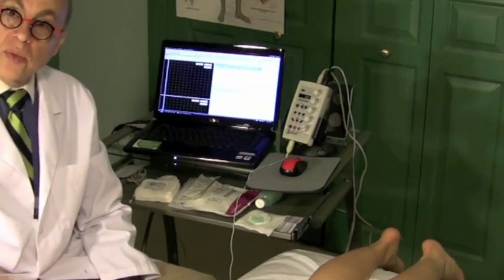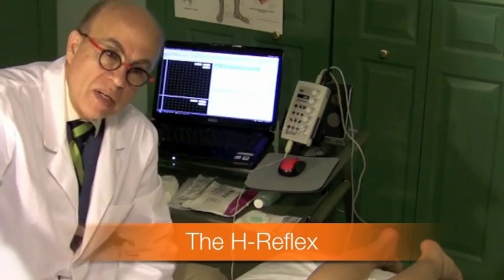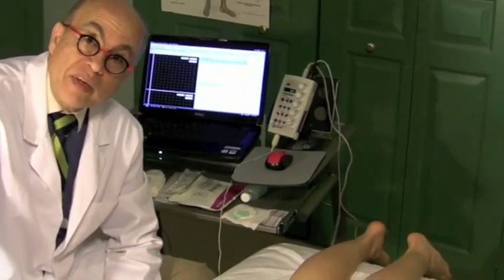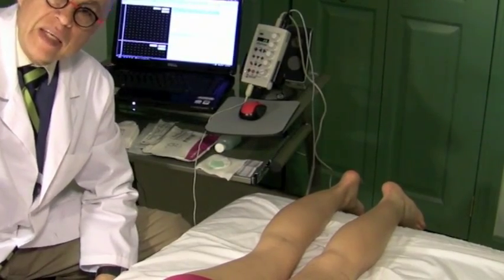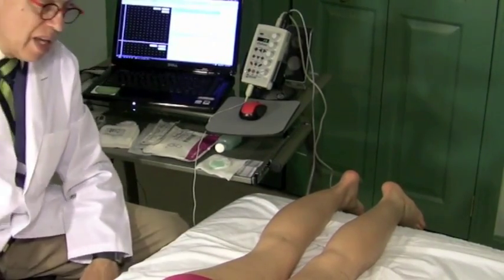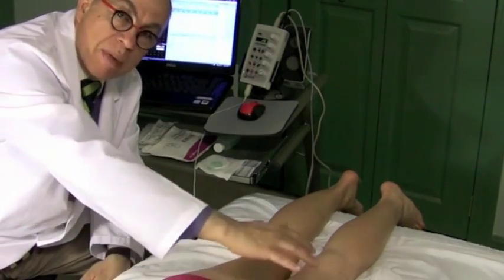And now we're going to do the last nerve in the lower extremity, and that's the H reflex. The H reflex actually is a reflex. It was discovered by someone by the name of Hoffman in 1918. That's why it's called the H reflex. And the H reflex also goes up to the back and comes right back down.